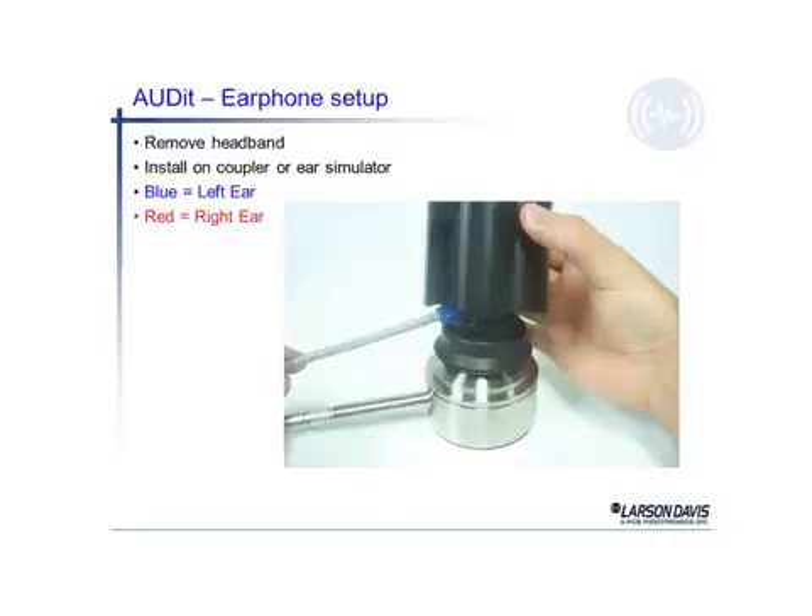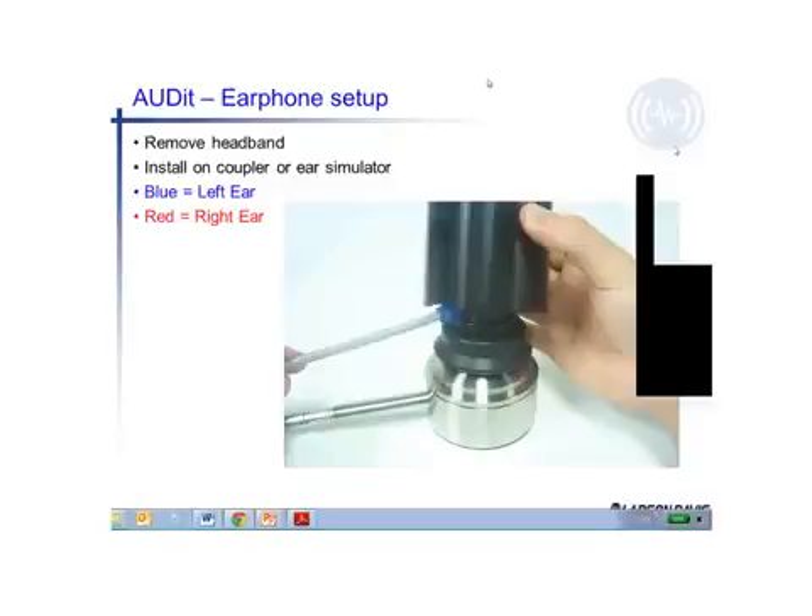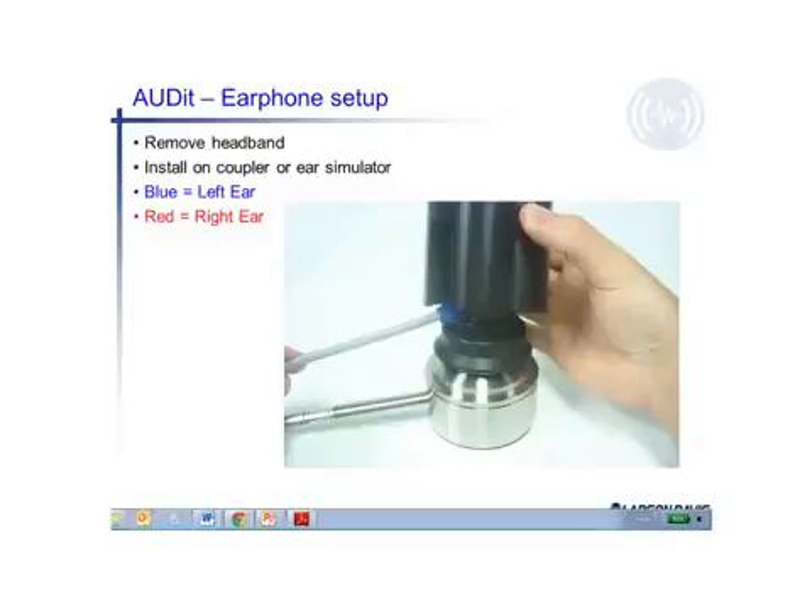Here's a picture of the artificial ear at the bottom — you can actually see the earphone. There's a little spot of blue on the earphone, which is typically used on the left ear, and earphones marked in red are typically put on the individual's right ear. You can see the little stand coming down over the earphone and the cable exits through a slot in the stand. The weight is put on top. You do have to remove the headband to allow the earphone to fit inside the coupler.